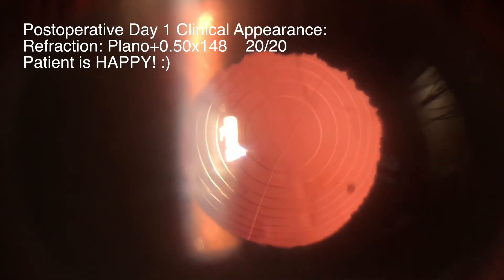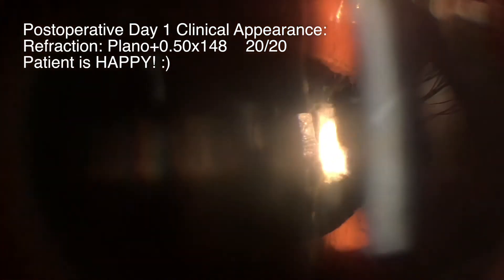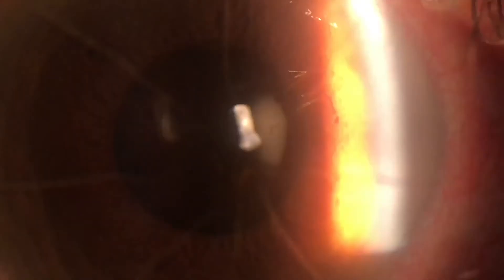As you can see, the patient's refraction was excellent on postoperative day number one. This case demonstrates that it is possible to place the Symphony lens into the capsular bag despite the absence of an intact posterior capsule. This individual was very happy with their visual outcome on the first day. Thank you for your time and attention.